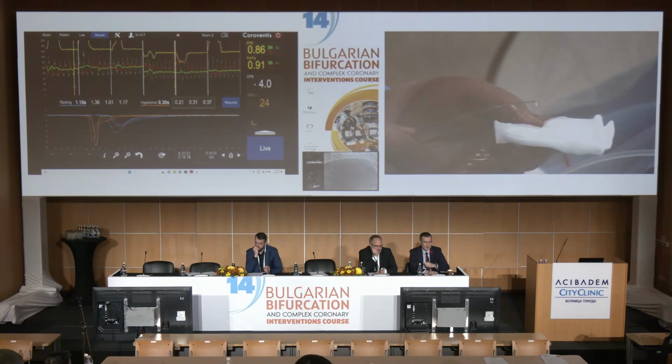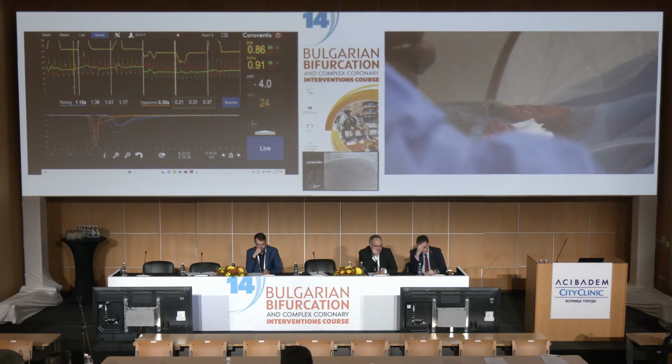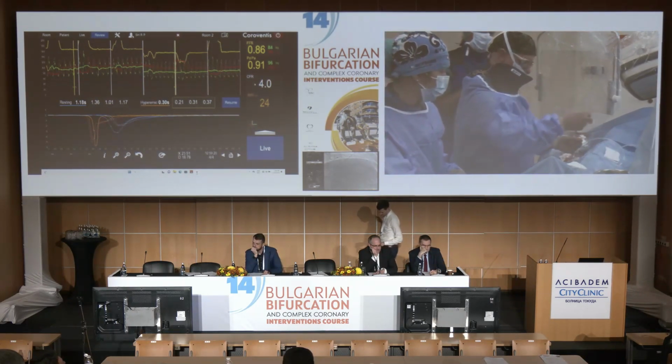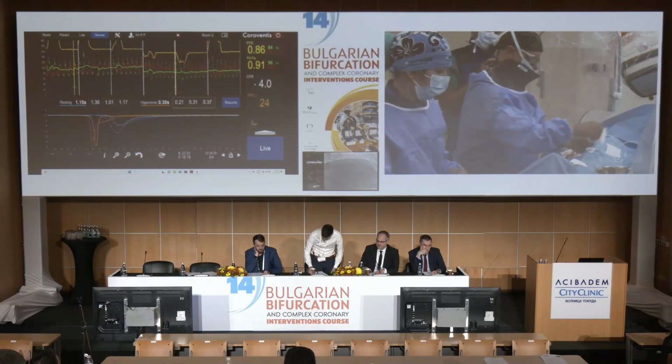It's important to see it clearly, to understand for the people, because the 4 holes are intended to allow perfect mixing. You have to eliminate all this. To perform perfect mixing of the saline with the blood.